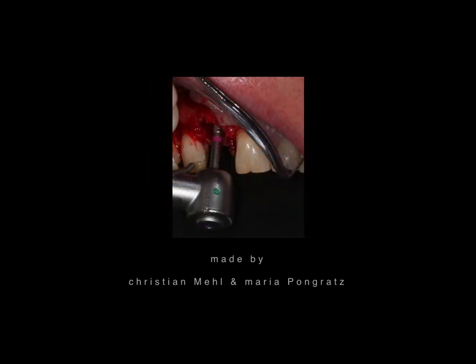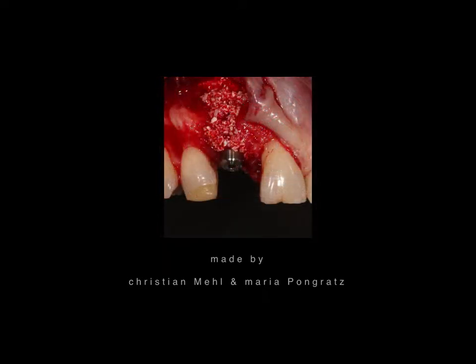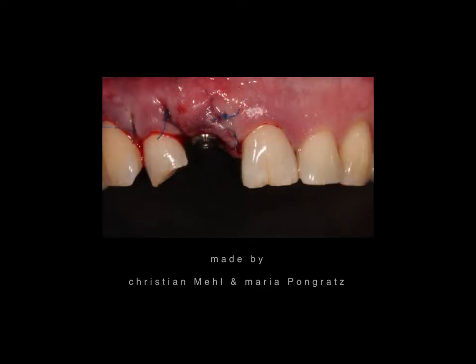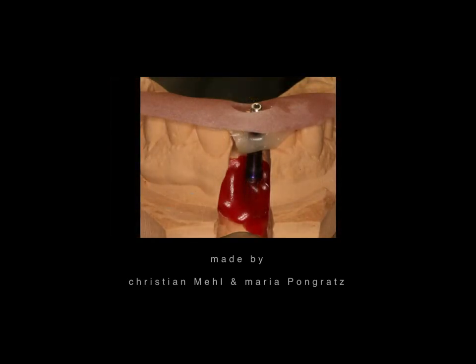I always, rather in the front, choose a diameter of the implant which is a little bit smaller, to make sure that we have no problem with the neighboring tooth or teeth. In this case, we can be fairly sure that the aesthetic result will not be perfect, but okay, as the neighboring teeth still hold the bone. We just filled the missing bone with bone of bovine origin, covered it with membrane, and are ready now to produce the temporary, which takes approximately 1 to 1.5 hours in the laboratory, and during this time the patient rests in our practice.